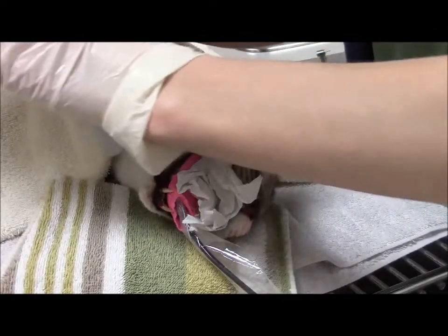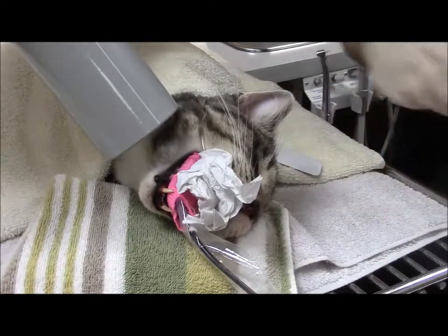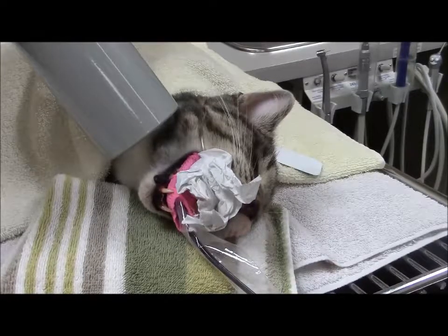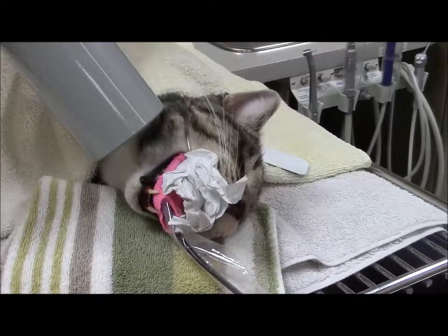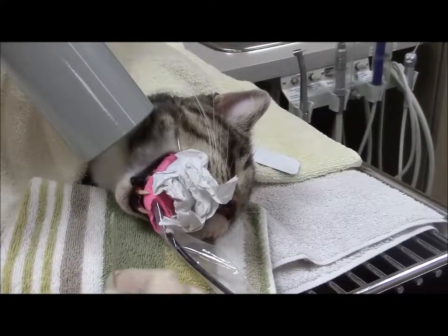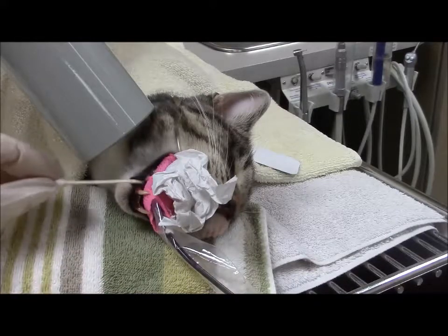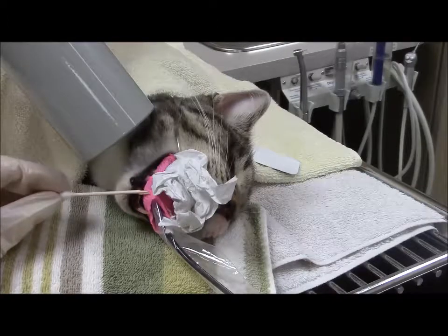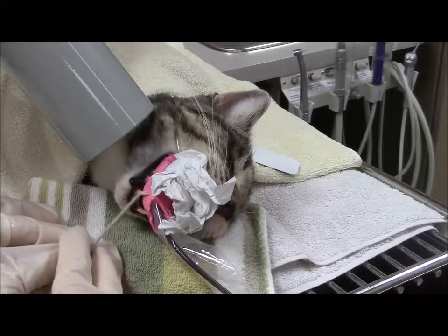And then because it's a tooth at the side, you're going to go to the front of the mouth to line up your angle. So at the front of the mouth, I'm going to use the front view of my sensor. So there's the front view of my sensor. The teeth as they go into the skull are going into the skull about like this. So halfway between my tooth angle and my sensor, which you can see here, leaves me about there.